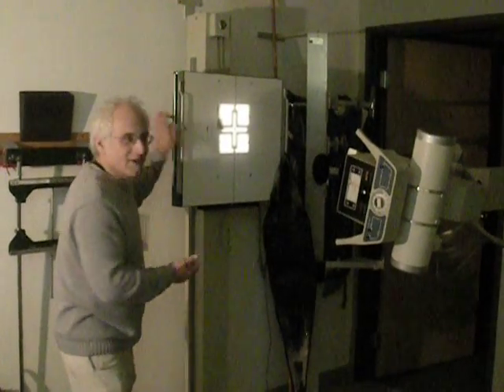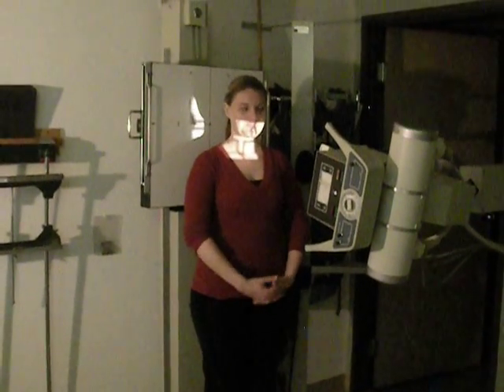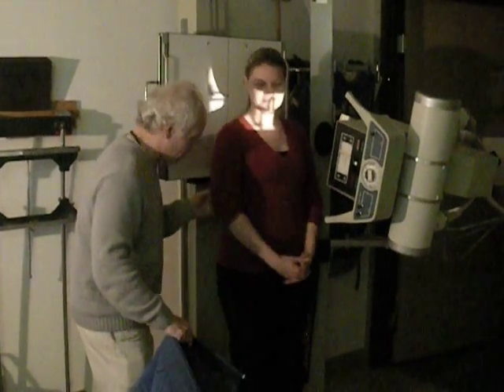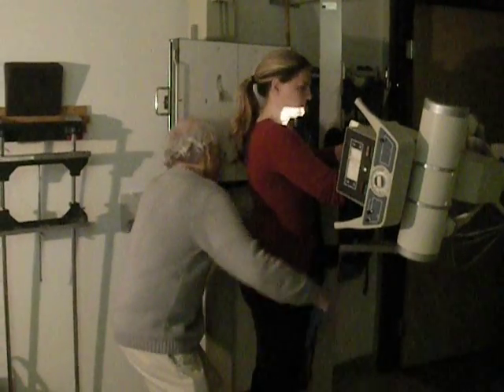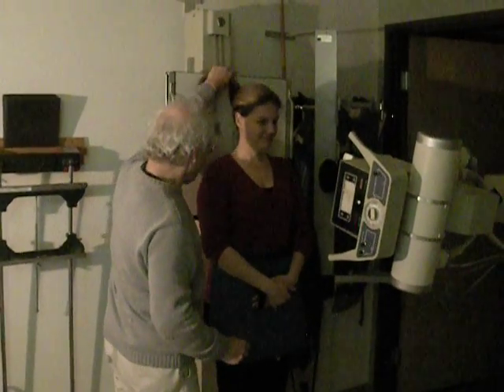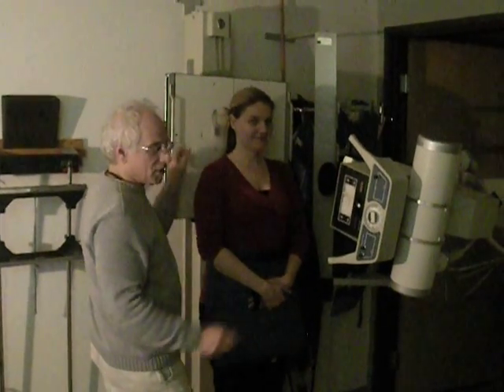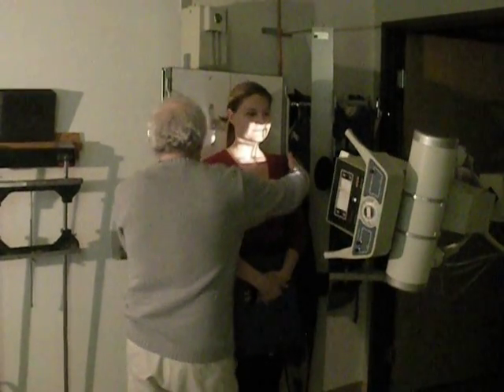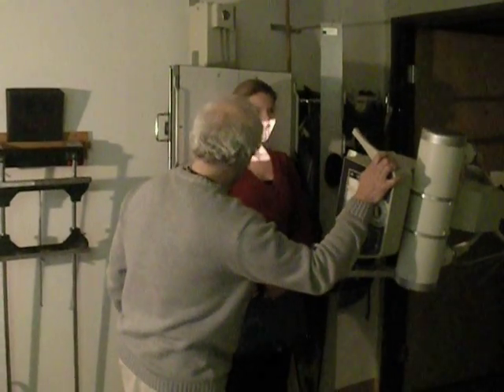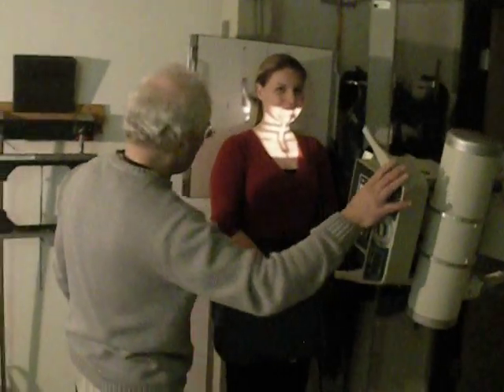See the film? Here. Come along now, Rachel. And here. Just for protective purposes, we're going to put this nice apron on our patient because we care. That's nice. Wrap it up. There you go. And of course we removed all this hair, and it wouldn't be in the picture because it would certainly obscure our view of the cervical spine, but for demonstrational purposes we'll just leave it there, if that's okay. And now we're moving the tube.